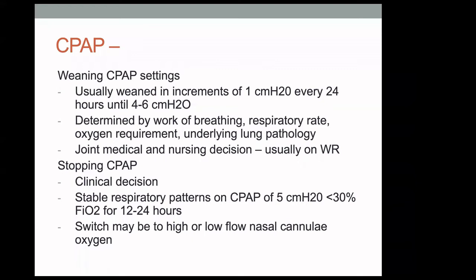Stopping CPAP is also a clinical decision, and babies need to be breathing regularly on CPAP of low pressures with low oxygen requirements for a good day or so before you would think about stopping the CPAP. You can extubate onto air if babies are stable, or you may switch onto high flow oxygen or low flow oxygen as required, and that's a clinical decision made by the team.